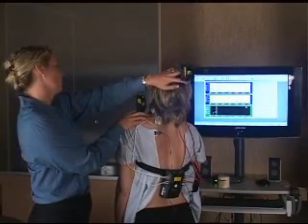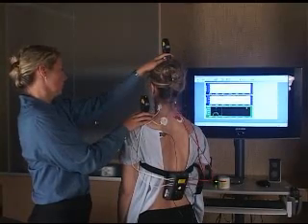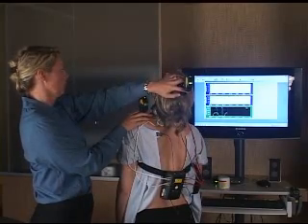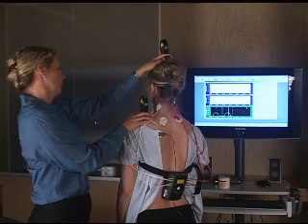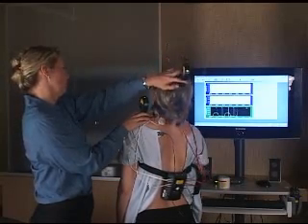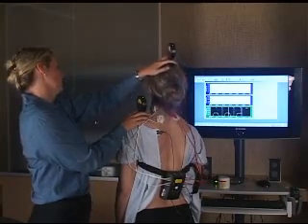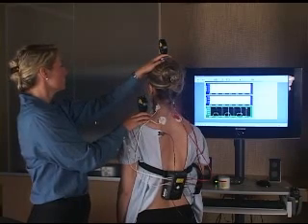We go to extension, wait for the muscles to relax, press one button, mark it, make sure it's marked on the screen, go back to extension, mark it, come back to the center, and mark it again by pressing and releasing the button. Go back to extension, mark it again by pressing and releasing the button, come back up to neutral, wait for the reading to drop and relax, and press and release the button.